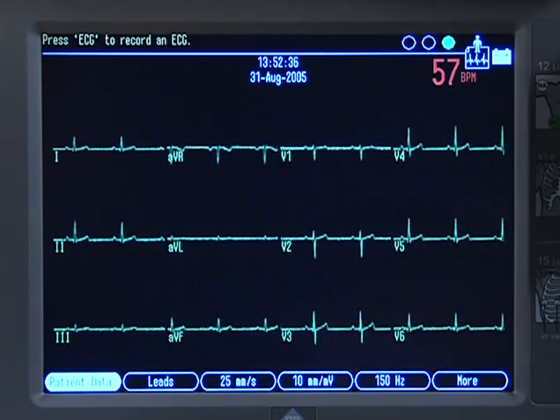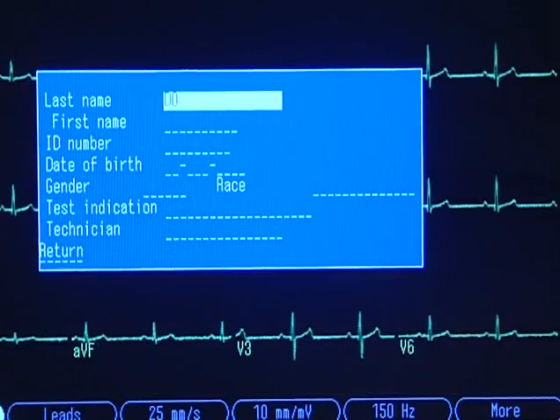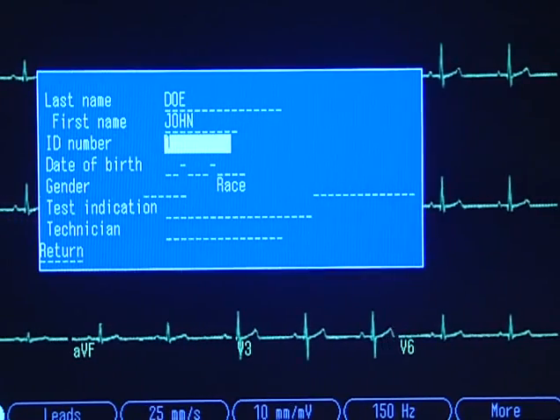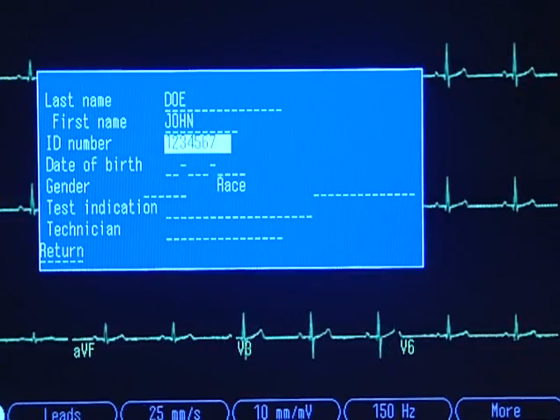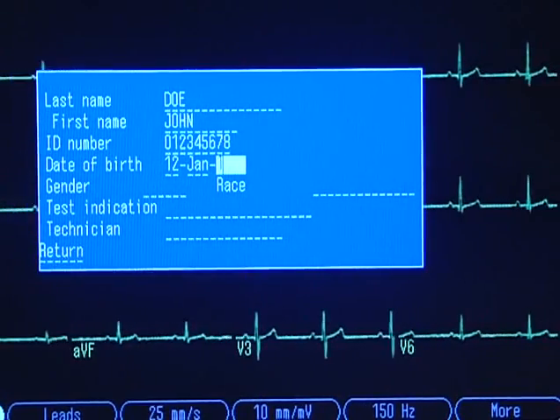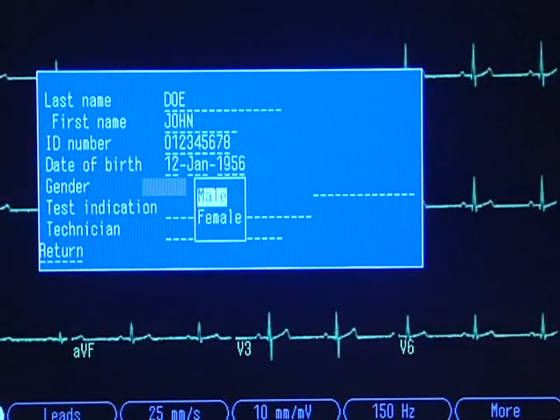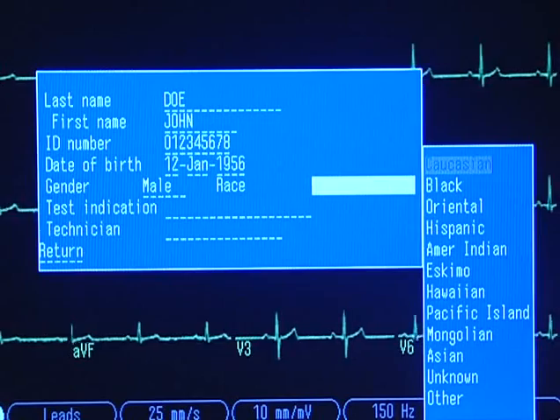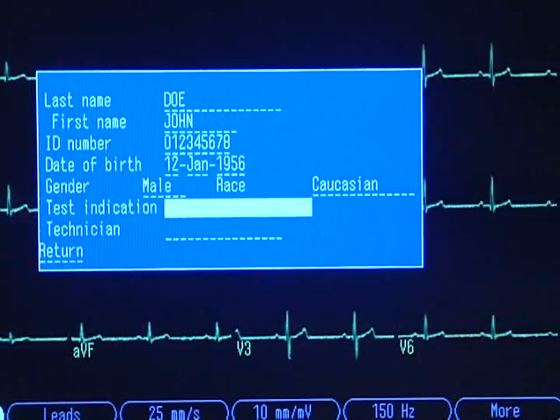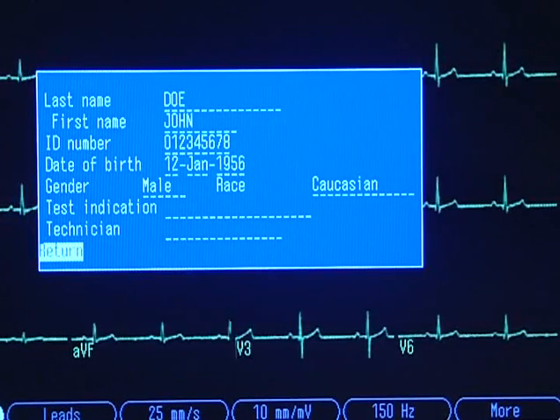Let's enter the patient data. Press F1 to access the patient data screen. Enter the patient name. Type in the patient identification number or medical record number and press enter. Type either the patient age or the date of birth — this value is used to factor the patient's age into the ECG reading. Gender factors into the analysis and interpretation of the ECG reading as well. When you have finished entering patient data, press the escape key or select return at the bottom of the screen and press enter.